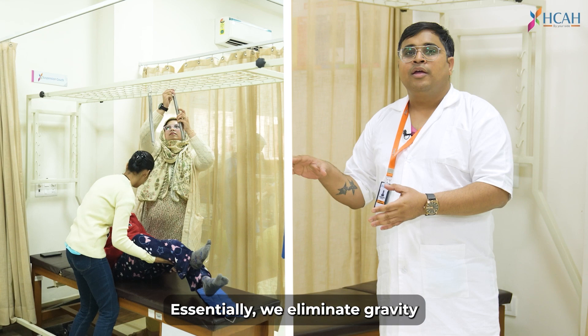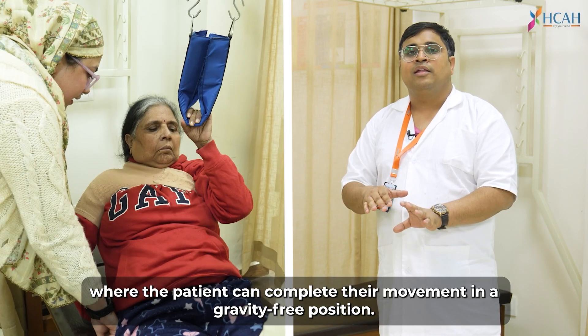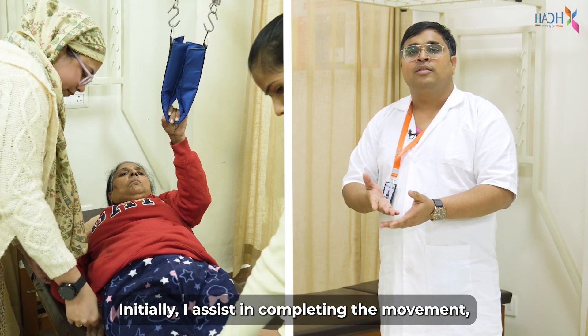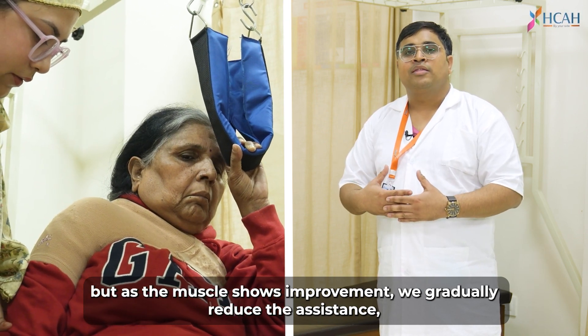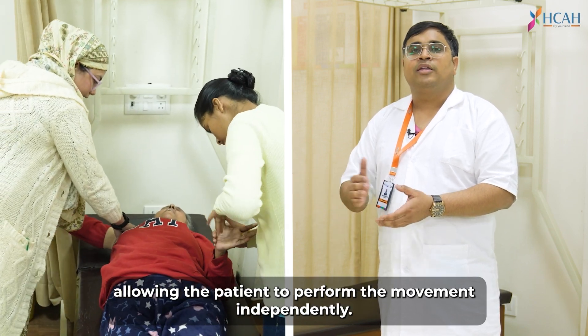Basically, we eliminate gravity, where the patient can complete the movement without gravity. In the beginning, there is assistance that helps to complete the movement. And as we feel that the muscles are doing better performance, we can remove that assistance and the patient can do all the movement.